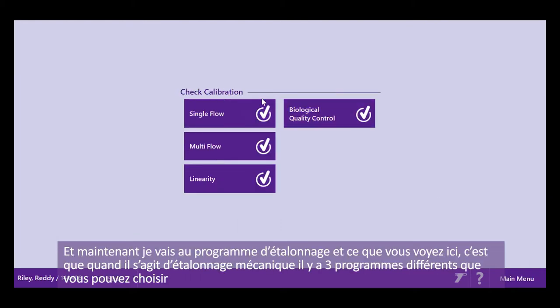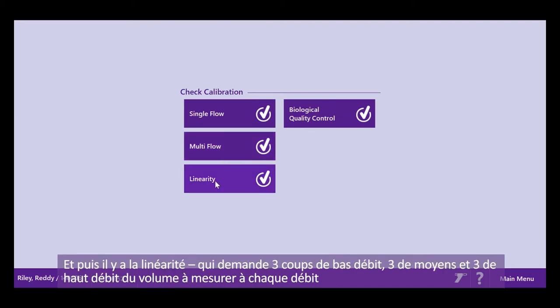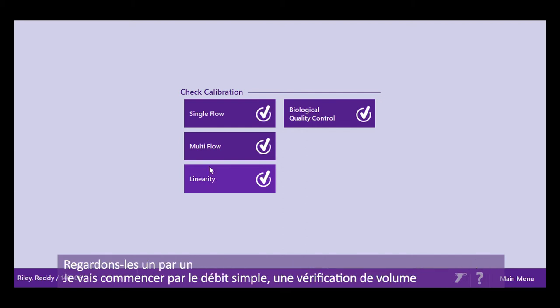Now I go into my calibration program. In the mechanical calibration, you have three different programs. You have single flow, which is simply a volume calibration check. You have multi-flow, where you look at the volume at different flow rates with just one pump of the syringe at each. And then you have a linearity check, which requires three pumps at low, three at medium, and three at high flow rates.